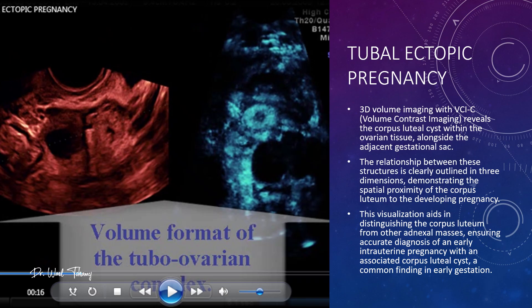Here is a 3D volume scan using virtual contrast imaging on plane C, VCI-C. Look closely — you can see the corpus luteal cyst within the ovarian tissue right next to the gestational sac. The three-dimensional view clearly outlines their spatial relationship, showing just how close the corpus luteum sits to the developing pregnancy. This is a great example of how 3D imaging can help distinguish a normal corpus luteum from other adnexal masses, ensuring you don't mistake a normal early finding for an ectopic.